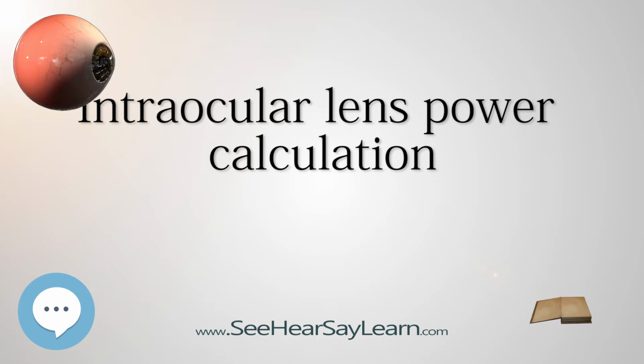Intraocular lens power calculation after refractive surgery. Cataract extraction following refractive surgery poses special problems for the patient and the surgeon because the corneal change as a result of refractive surgery complicates accurate keratometry, a key element of lens implant power calculation. After laser refractive surgery for myopia, this could result in overestimation of corneal power, underestimation of the IOL power required, and hyperopic outcomes after cataract surgery.